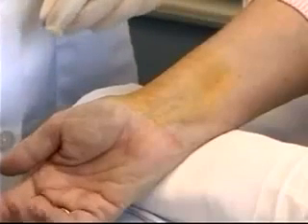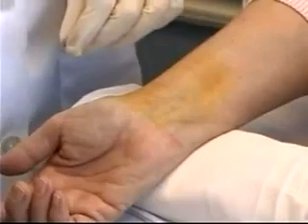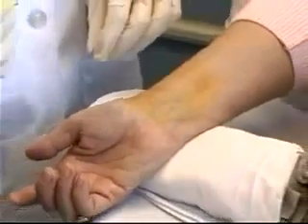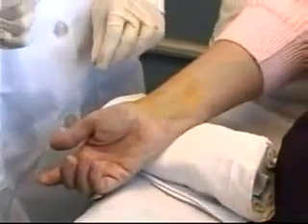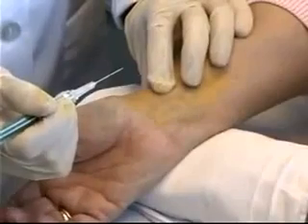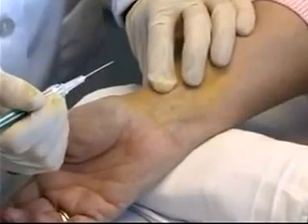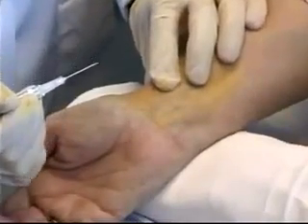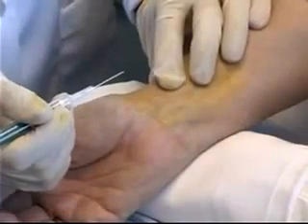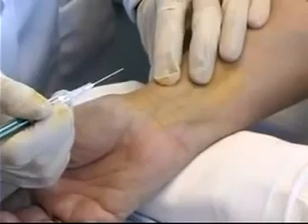I'm going to hold the syringe a little differently for the blood gas procedure. It's going to be at a sharper angle, closer to 45 degrees, and I'm going to hold it much like a dart or a pen. I'm going to feel for that pulse, and that pulse is truly my only landmark for knowing where I'm going to break the skin with this needle.